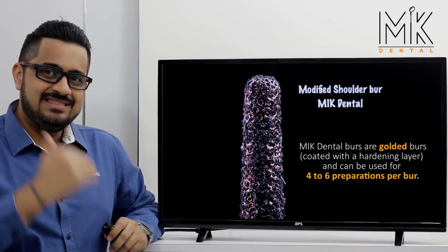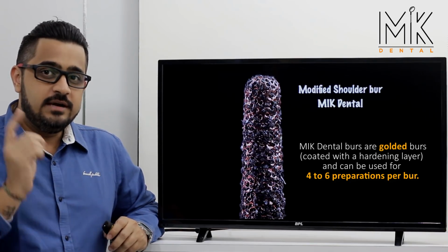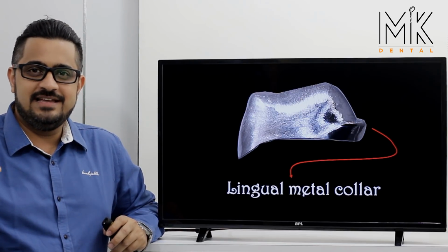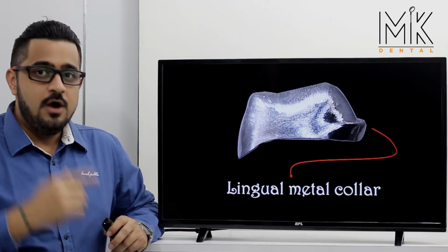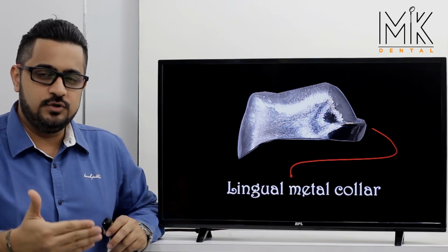However, if you look at the lingual or the palatal aspect of PFMs that come to you, the coping itself will have what is called a metal collar. You will realize, friends, that the lingual or the palatal margin does not have ceramic layered on it. One of the reasons why we do this is in an attempt to conserve tooth structure.